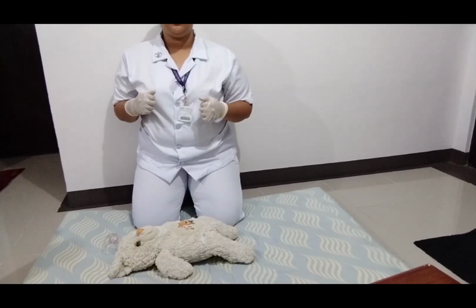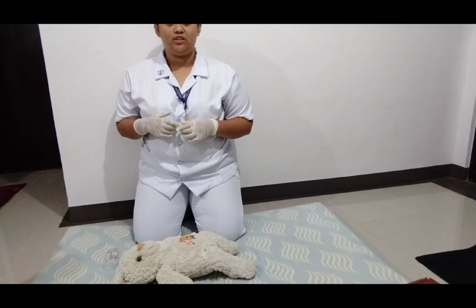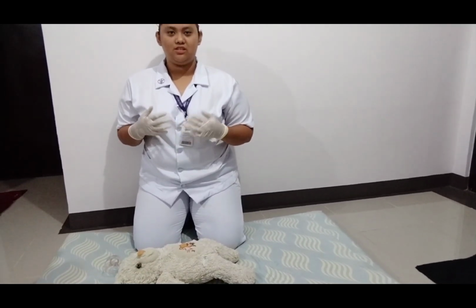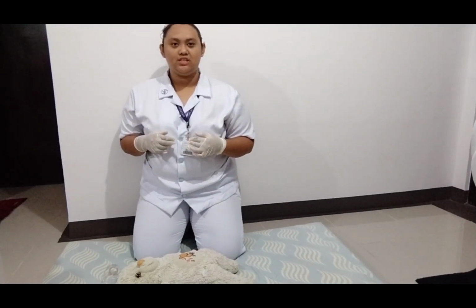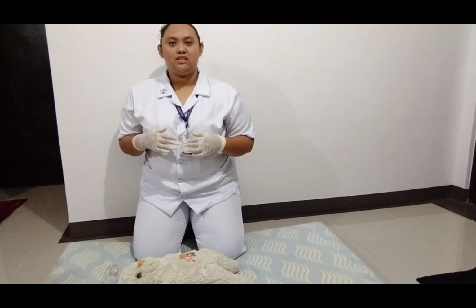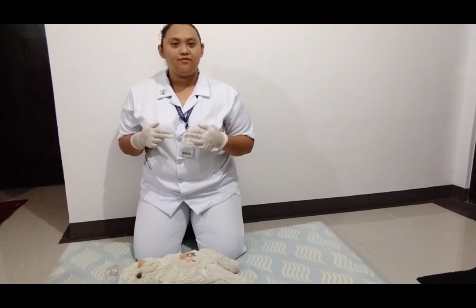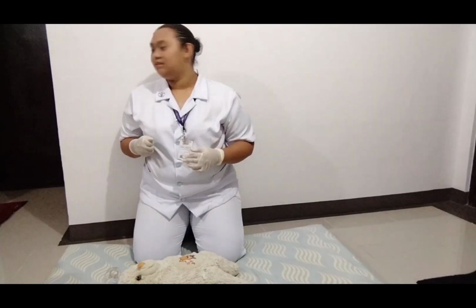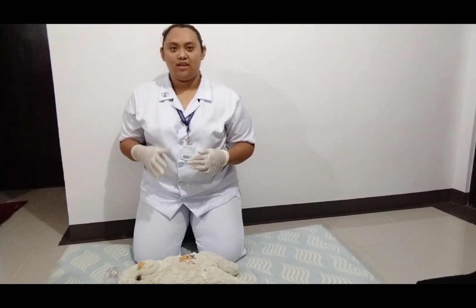Now I am going to proceed with the pediatric resuscitation. So this involves a child or an infant who needs immediate resuscitation. So basically, the steps in doing this procedure are just the same as the adult CPR. The only difference is the number of hands or the fingers used in the chest compression. So to begin, we'll still have to check the environment. Make sure that the scene is safe.